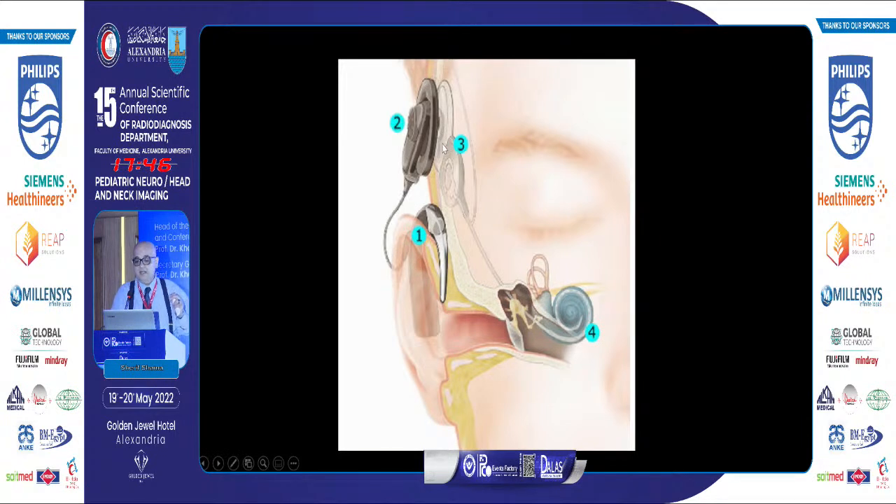Here is the whole system and how it works. The external part includes the transmitter and the microphone — this must be removed before imaging. The internal implanted part consists of the receiver, the stimulator wire inside the cochlea, and the ground wire.